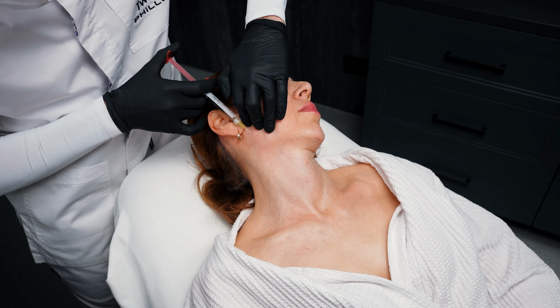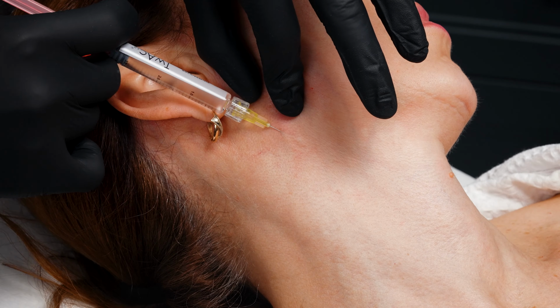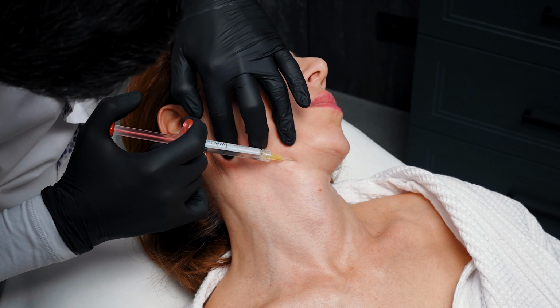Today we will discuss how to work with TwAc 2.0 in the neck and decollete areas. The main indicators include skin laxity, dryness, wrinkles and the appearance of so-called venous rings, skin discoloration, pigmentation and papillomas.